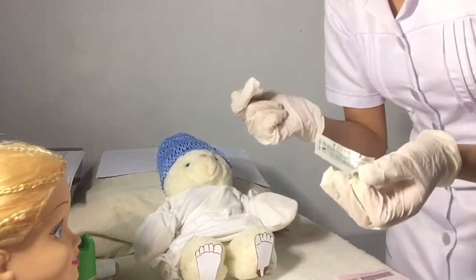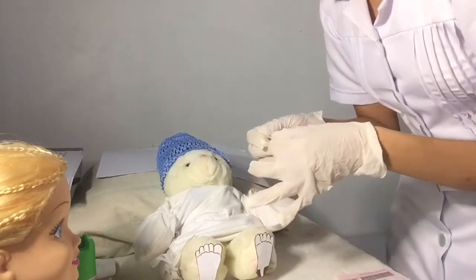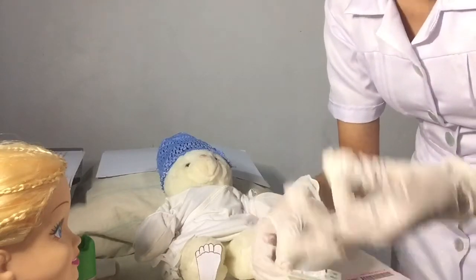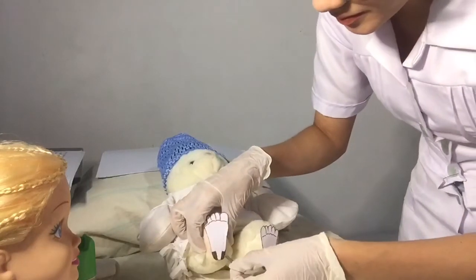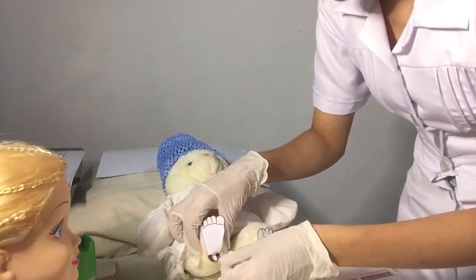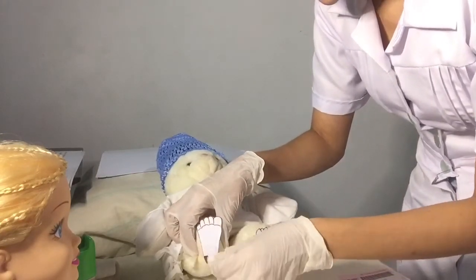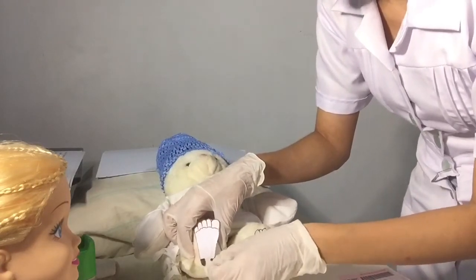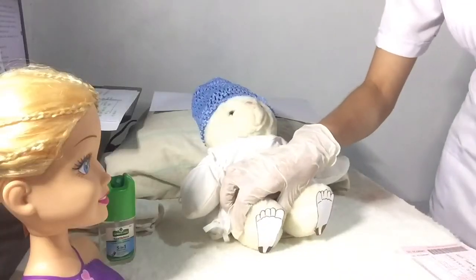but medyo mahirap yung gamitin. So, also if not available, kung ano ang gagamitin nyo, the pricking must be controlled, okay? Okay, this one. Then we are going to prick. After pricking, the first blood is wiped off with cotton, kasi sometimes it may contain yung cell, alcohol, or excess tissue fluid which may distort the test results. So we are done pricking the baby's heel.